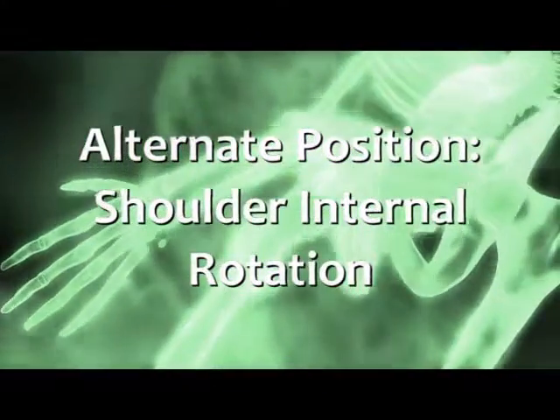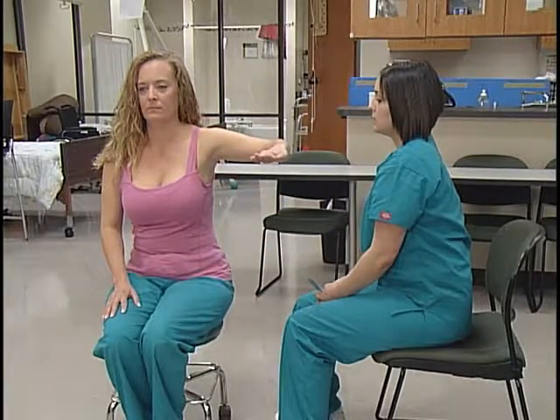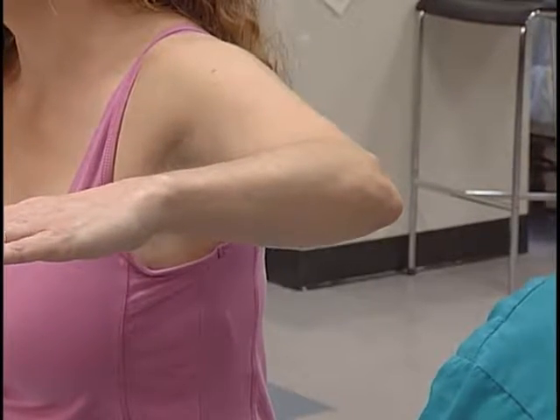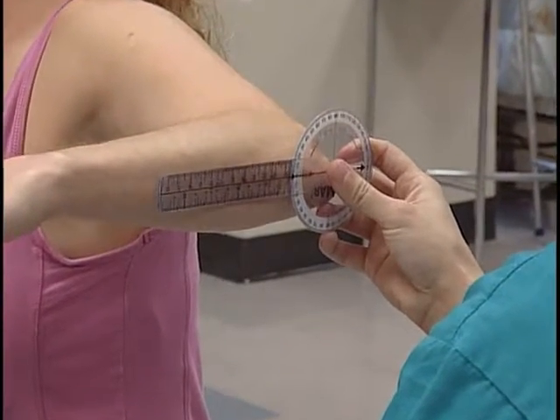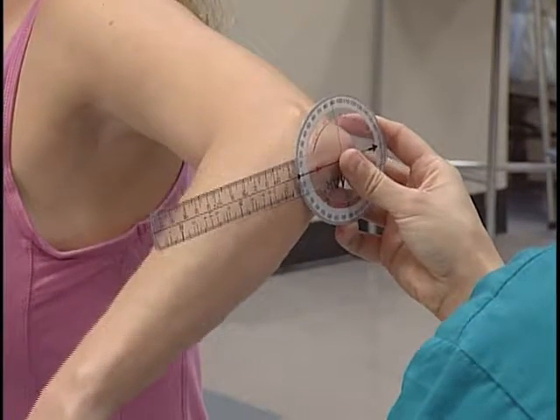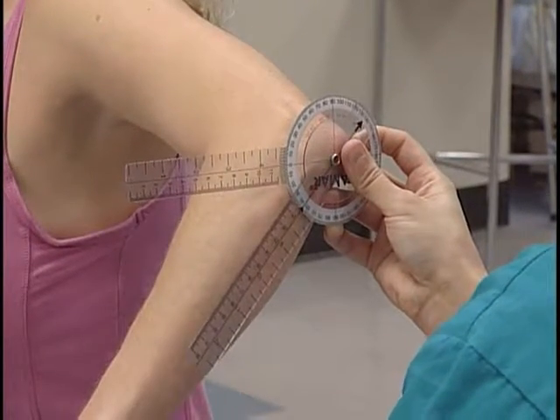For an alternate position to measure internal rotation, the subject is seated with the humerus abducted to 90 degrees and the elbow flexed to 90 degrees. The axis of the goniometer is on the olecranon process of the elbow, and the stationary bar and movable bar are parallel to the forearm. The client's forearm is swung down gently, keeping the humerus parallel to the floor. The measurement begins at zero degrees and ranges to 70 degrees.